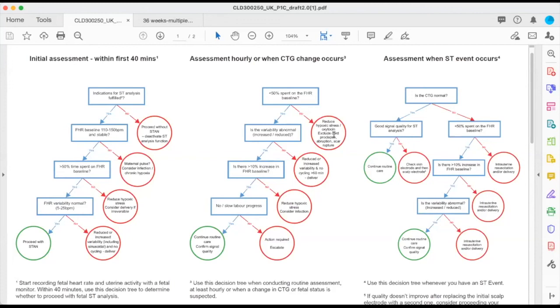So if I have a hypoxic CTG where I'm pushing things towards the limit, if I'm not getting a check every minute, I might not have enough checks to tell me when the baby is becoming unwell. Remember, the machine is checking for 2 things, the ratio and the shape. The shape, it can figure out whenever it does the check.